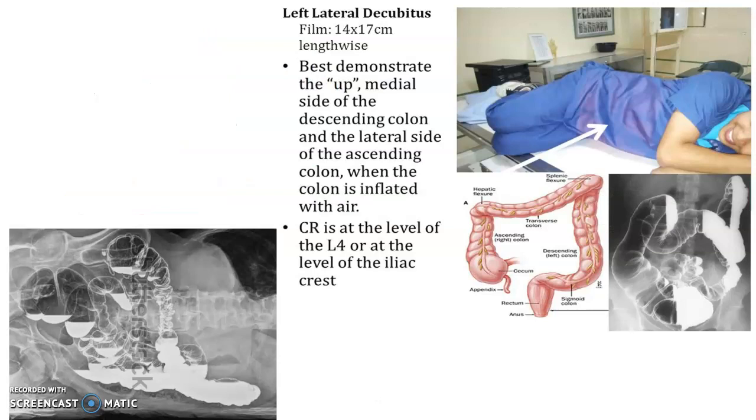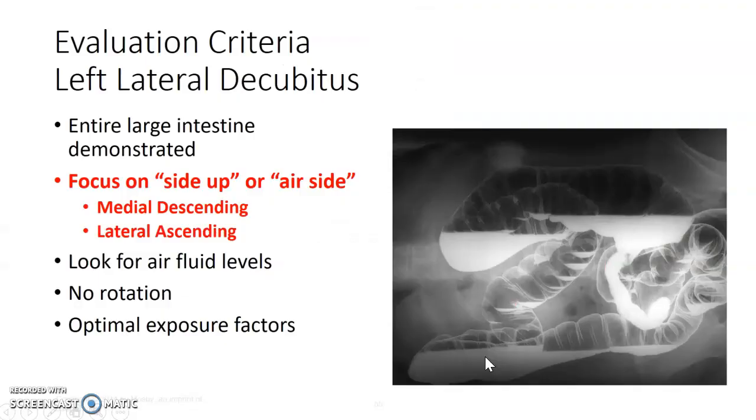Then your left lateral decubitus, you're just going to flip everything. Same thing, we're looking at side up, and that's going to be the air side because air rises, fluid drops. So medial descending, lateral ascending. Okay, which side are you looking at? Side up, we're looking at this side up with air.